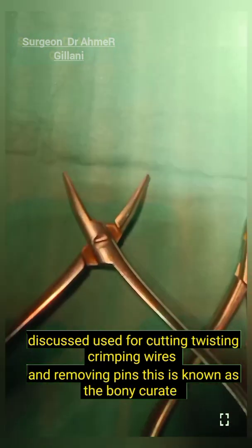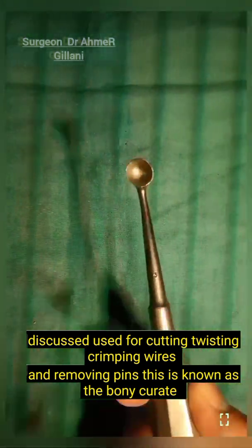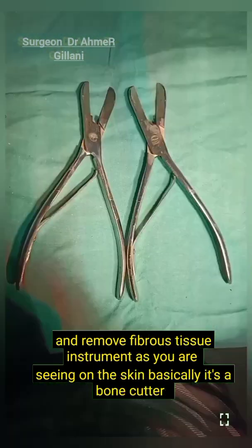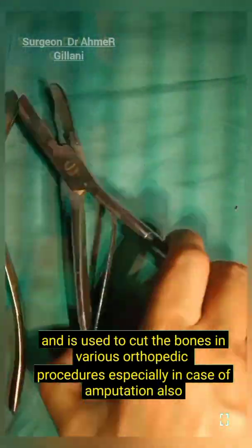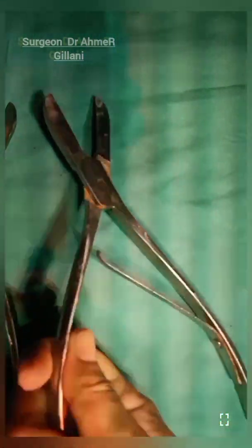Again you are seeing different types of pliers — used for cutting, twisting, and crimping wires and removing pins. This is the bone curette, a debulking instrument commonly used in orthopedic procedures to scrape away and remove fibrous tissue. The instrument you are seeing is a bone cutter, used to cut bones in various orthopedic procedures, especially in cases of amputation.